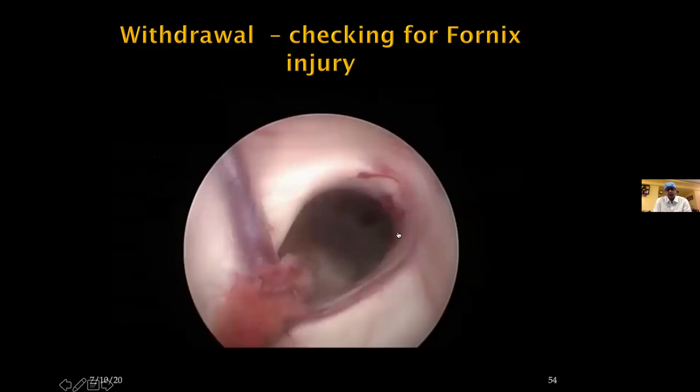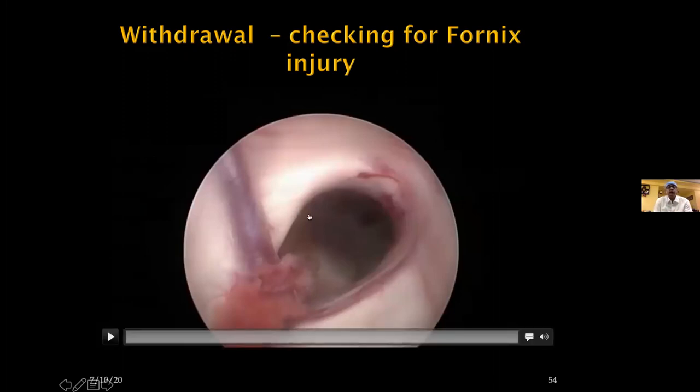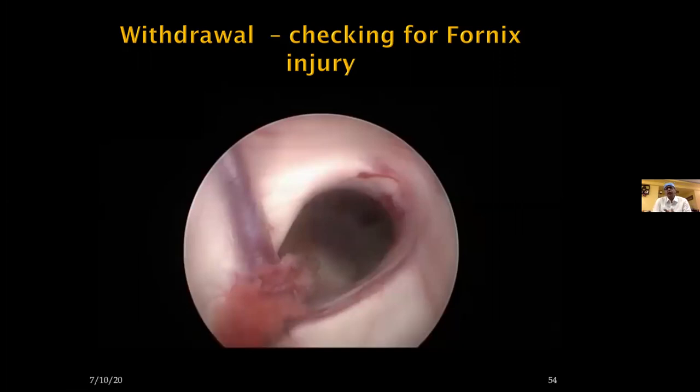So the endoscope in the next step will need to be gradually withdrawn from the third ventricle into the lateral ventricle, where we again need to stop for some time and inspect whether it has been damaged. Especially while doing work inside the third ventricle, the rigid endoscope will be hinged on the fornix, and there is a chance of damage to the fornix, both to the body and to the two horns of the fornix. There may be a chance of damaging the small blood vessels that accompany the choroid plexus, that is the branches of the medial posterior choroidal arteries and the small choroidal veins. So hemostasis will be required at this step.